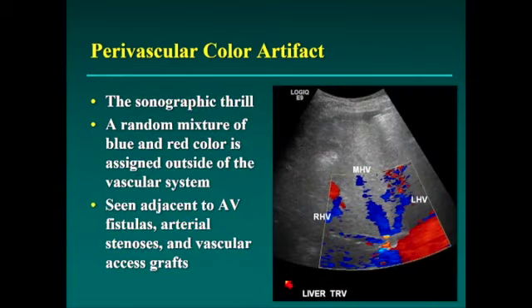And so this perivascular color artifact is sort of the sonographic thrill.